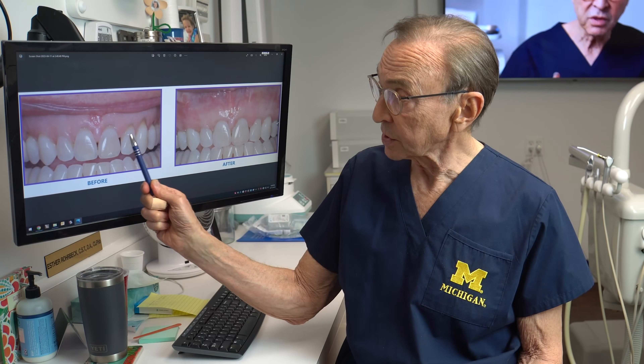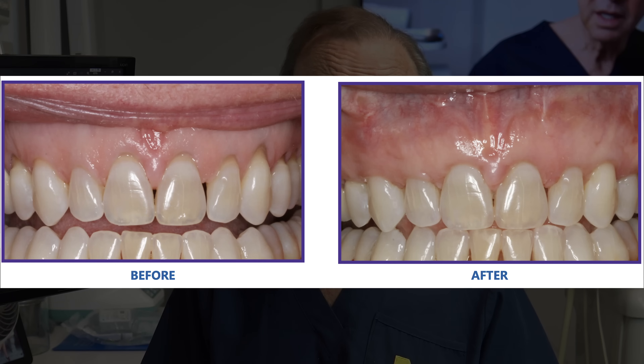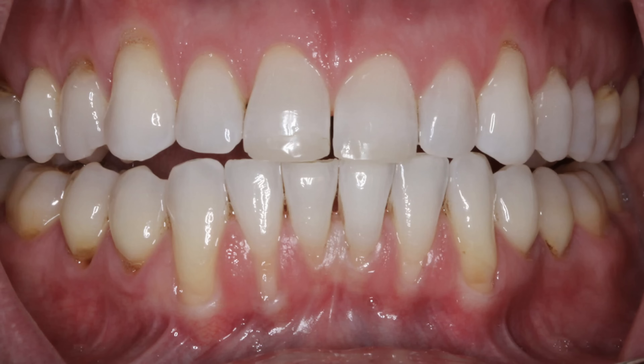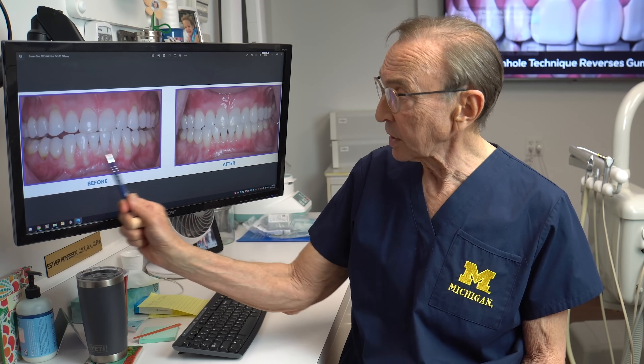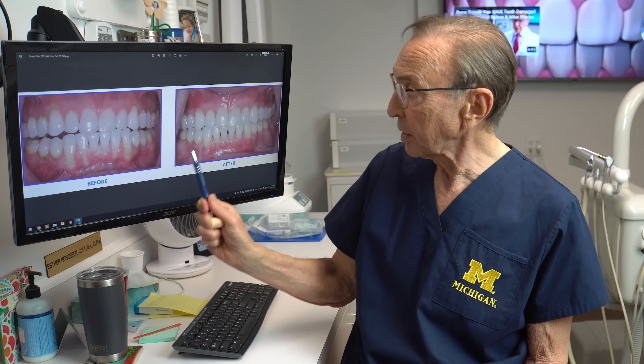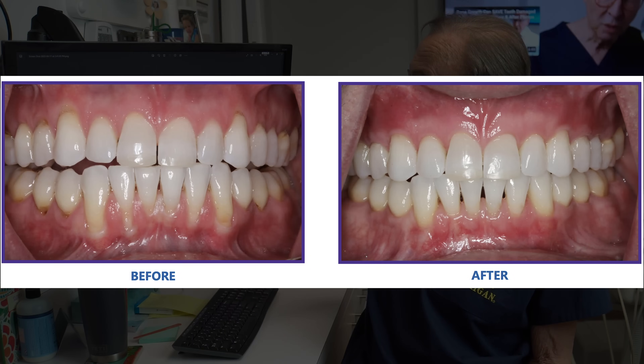And another case — recession, recession — we brought all of that tissue down. The patient was very happy, happy to smile, happy to have less sensitivity, happy to have thicker tissue to prevent further destruction. This was a very interesting case, especially the lower — tremendous amount of bone loss, these teeth were getting loose. You can see all of this bone loss down here particularly, and also some on the upper. And again with the pinhole technique, we were able to cover most of those roots on the lower and on the upper.